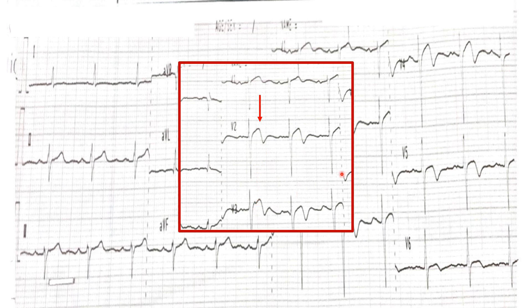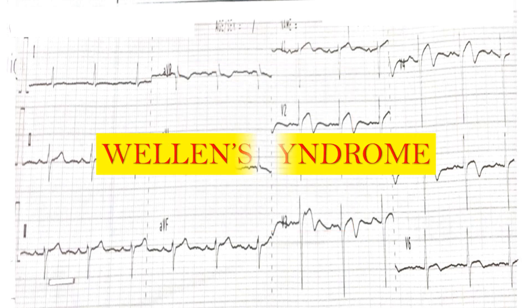Now look at leads V4, V5, and V6. These T waves are also called biphasic T waves. In leads V5 and V6 they have extended, meaning the whole of the chest leads are showing these findings. This condition is called Wellens Syndrome.